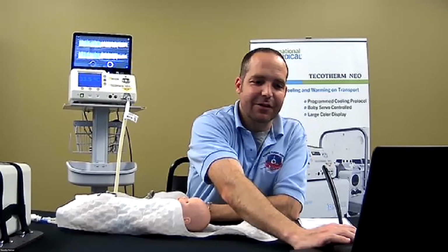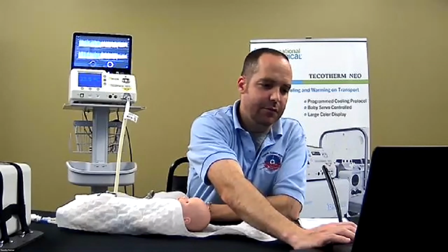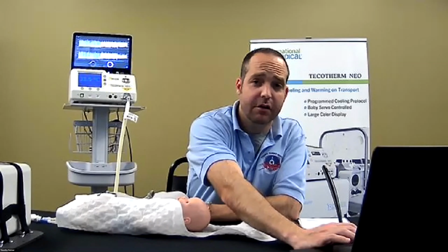With those, it's just basically monitoring to make sure it's not popping out, keeping it secure in there, and making sure the site is as clean as we can. But what I like about the Tecotherm too is it's quick to tell you if something's wrong, and you'd be able to correct that intervention really fast.